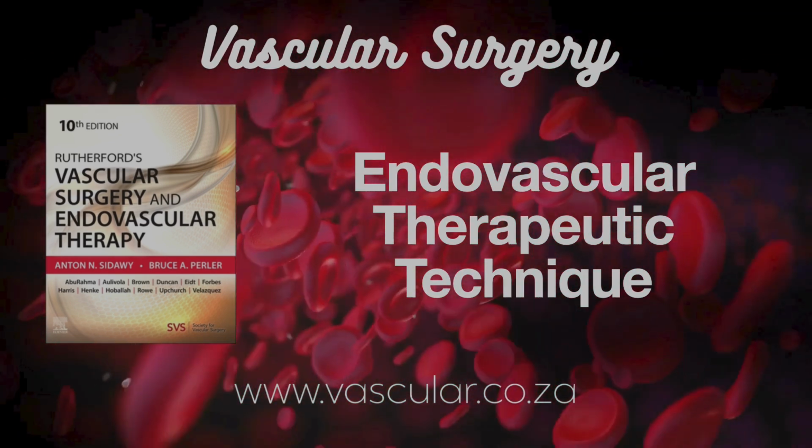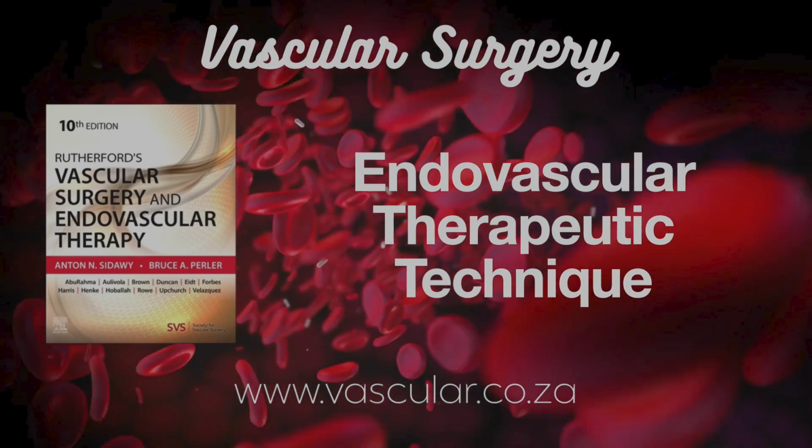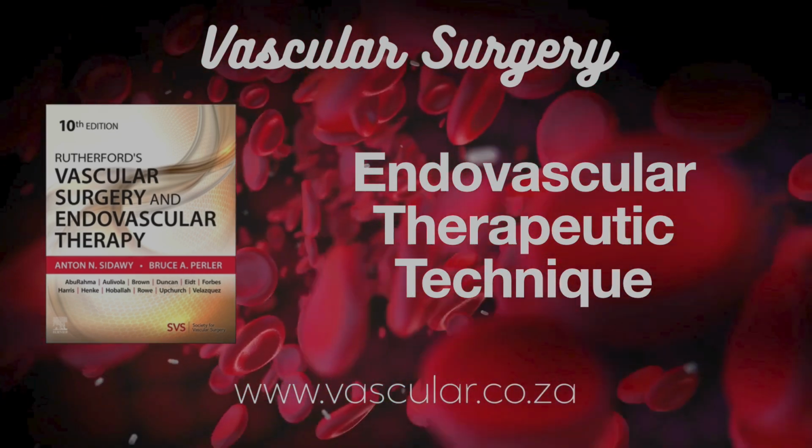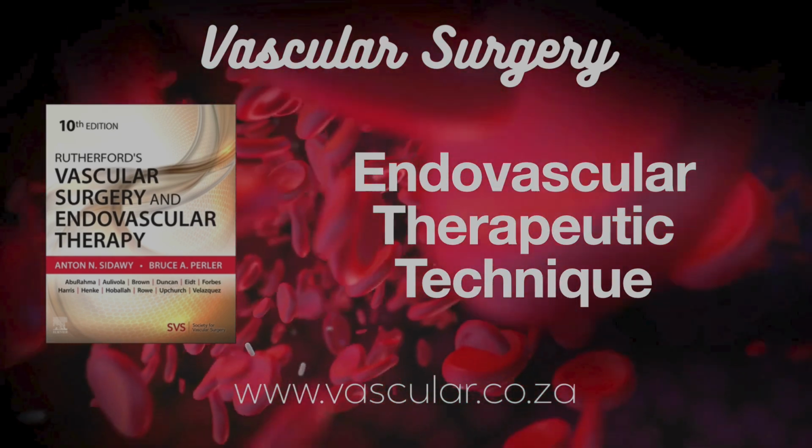And rotational thrombectomy, similar to rotational atherectomy, but for clot. Pretty much. Uses a mechanically rotating element to macerate and remove thrombus. The Rotarex system has a rotating tip, maybe 40,000 RPM.